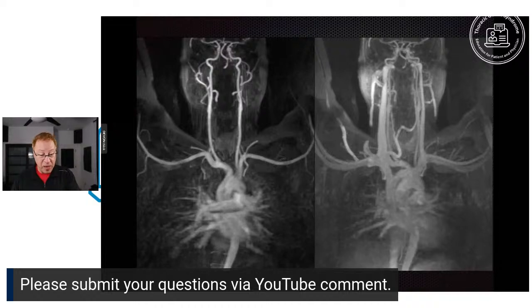Now, if we give contrast, on your left side, you'll see a beautiful MR arteriogram. This is with contrast, but the contrast is not nearly as bad for the kidneys. And we don't need to use any X-rays for this. This is done in a magnetic field with no X-rays. And the images are darn nice. If you look on the right side, it's the same patient. We just waited longer, and then we took pictures and have a venogram as well.